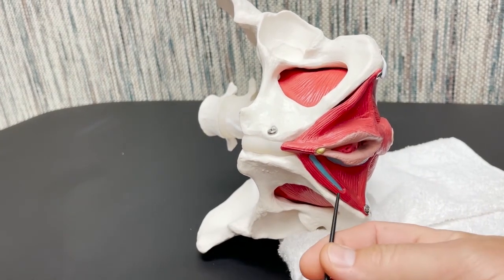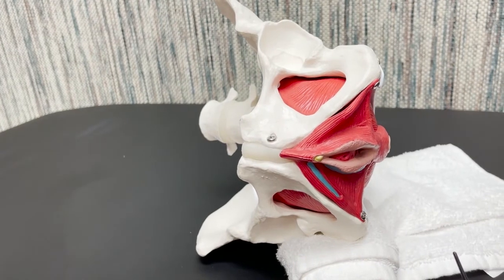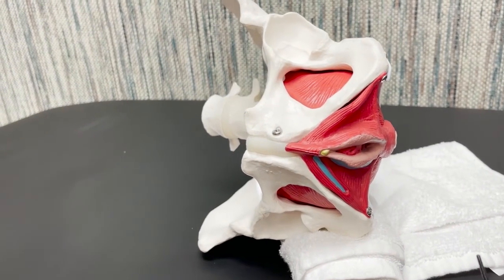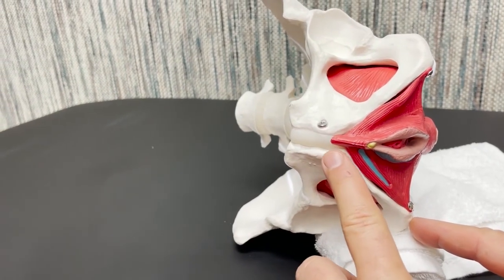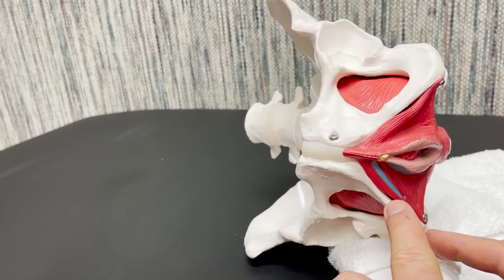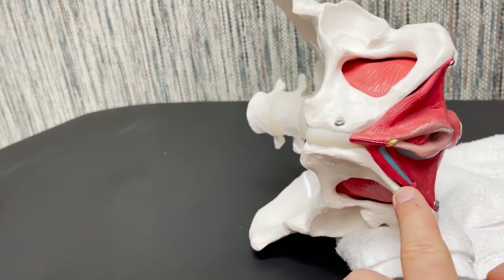With that, making sure that we're going posteriorly to stay away from the labia. For the male, we're going to use the same ischial tuberosity and the pubic symphysis at a midpoint, but here we're going to needle parallel tangent relative to both ramus.